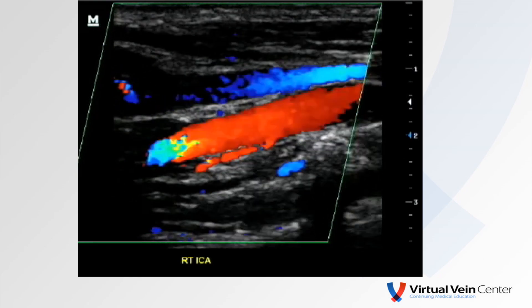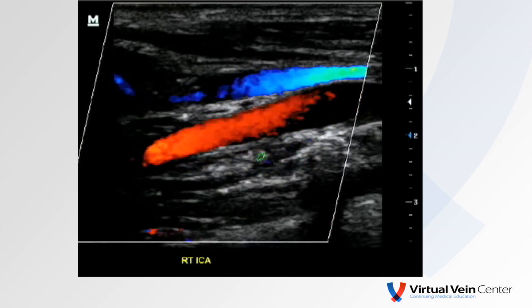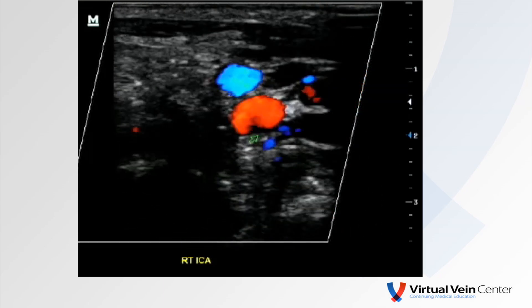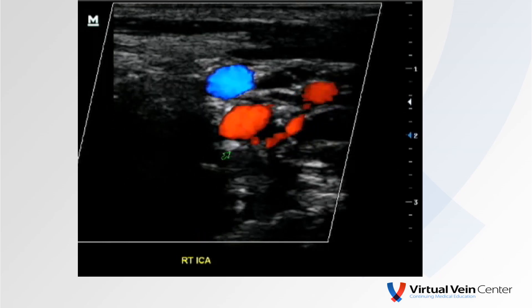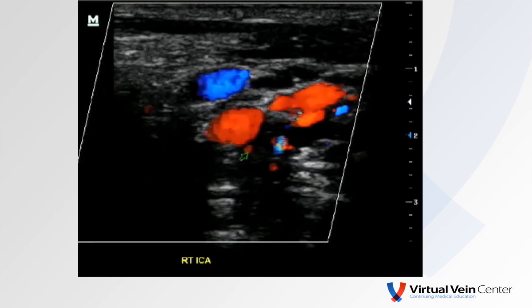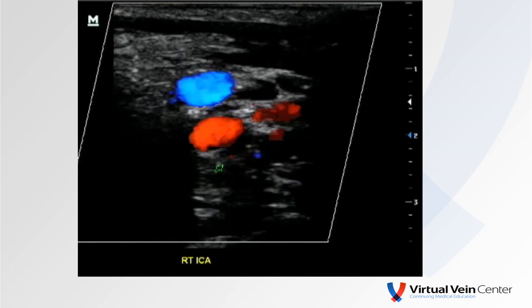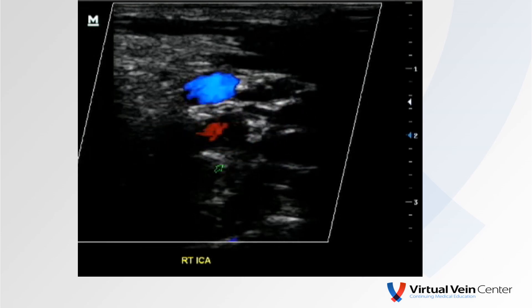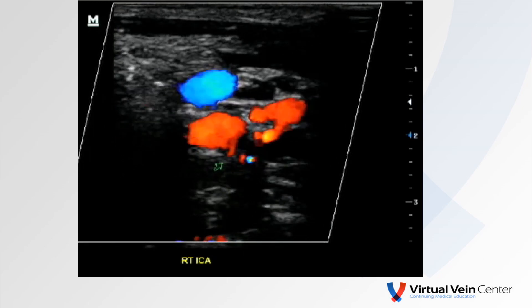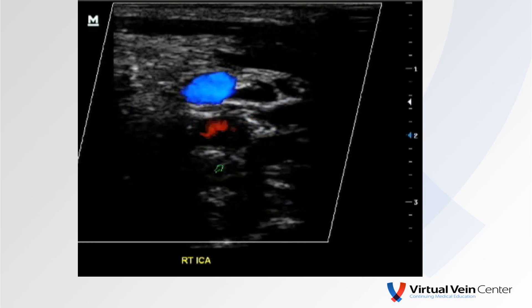Here's the patient I did last week. We can see a high quality image with what certainly appears to be a branch coming off this vessel. I assume that's the ICA — it has a low resistance waveform. I turn transversely and confirm that little branch coming off the internal. Over to the right in transverse, I see the external — no flow during diastole, a high resistance flow pattern, and actually multiple large branches arising from the external carotid artery. So I'm convinced I have differentiated internal from external, and confirmed in both longitudinal and transverse that I have a branch coming off the internal carotid artery.